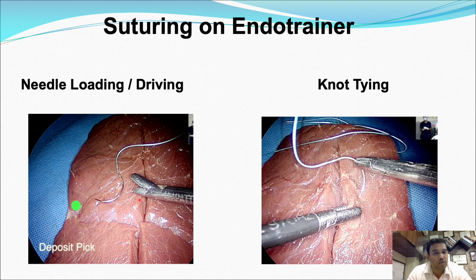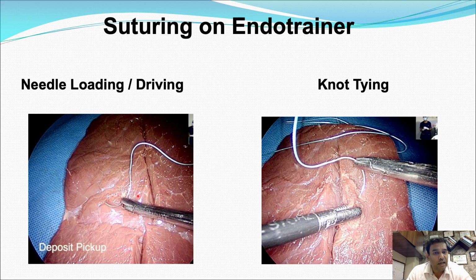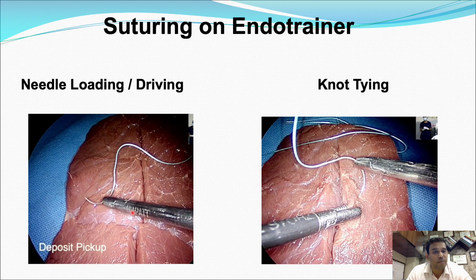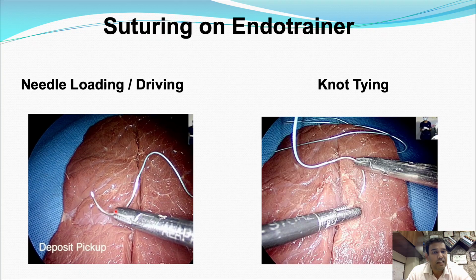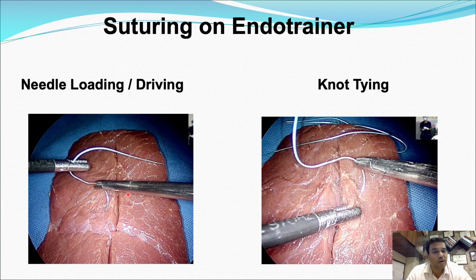Similarly, you can do it with the smiling position also. You bring the needle holder and press over the tissue and then it will automatically direct itself at the right angle and you hold it with the tip of the needle holder. This is called the pick up and drop technique.